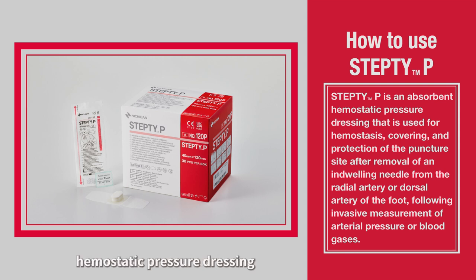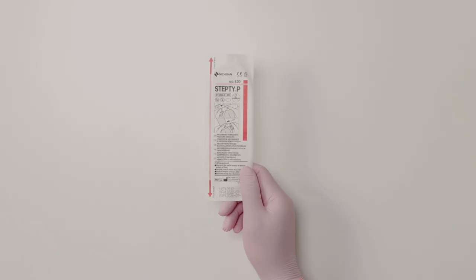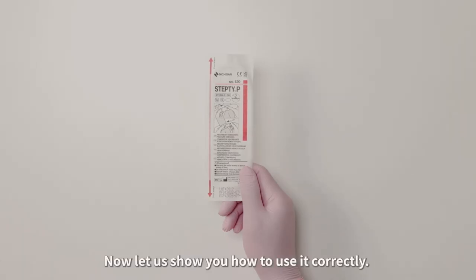STEPTY P is an absorbent hemostatic pressure dressing used for hemostasis, covering, and protection of the puncture site after removal of an indwelling needle from the radial artery or dorsal artery of the foot, following invasive measurement of arterial pressure or blood gases. Now let us show you how to use it correctly.